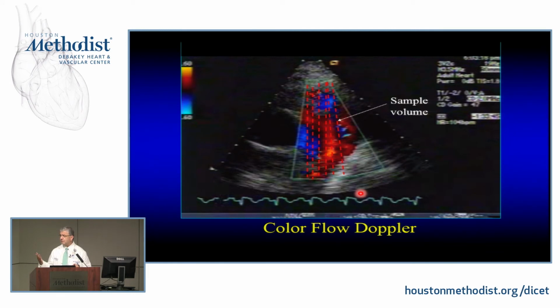And it took a couple of years for people, believe it or not, to agree what color to give it. There was some camp that said blue is coming towards you. No, red coming towards you. Okay, we solved that part of the equation. It was very hard. But that's what color Doppler is about.